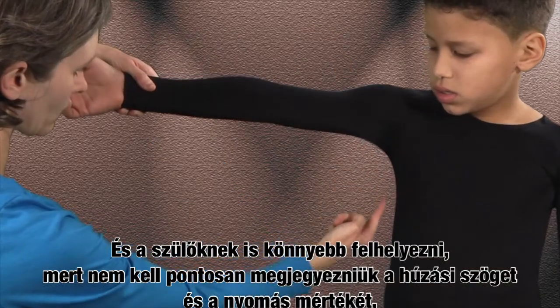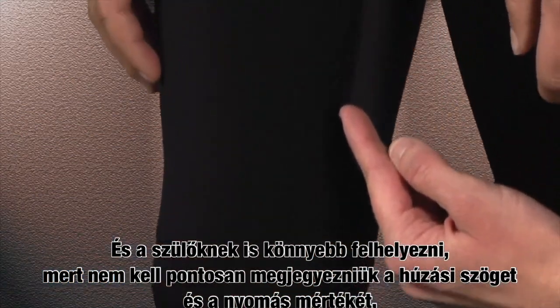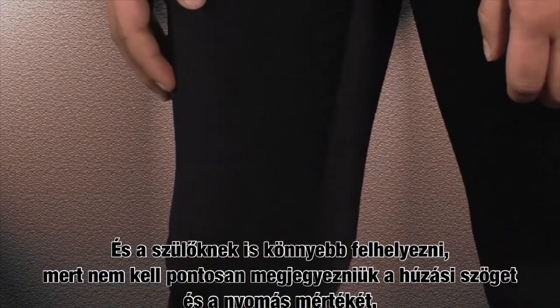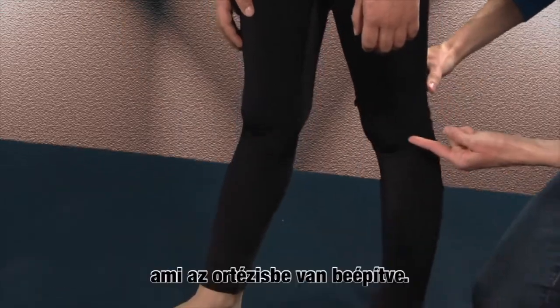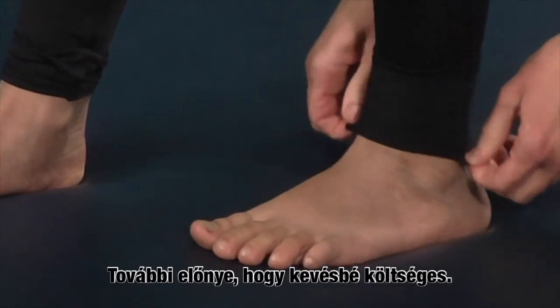and it is easier for parents to put on because they don't have to remember exactly the angle of pull and the amount of pressure that is built into the orthosis. Another advantage is it's less expensive.